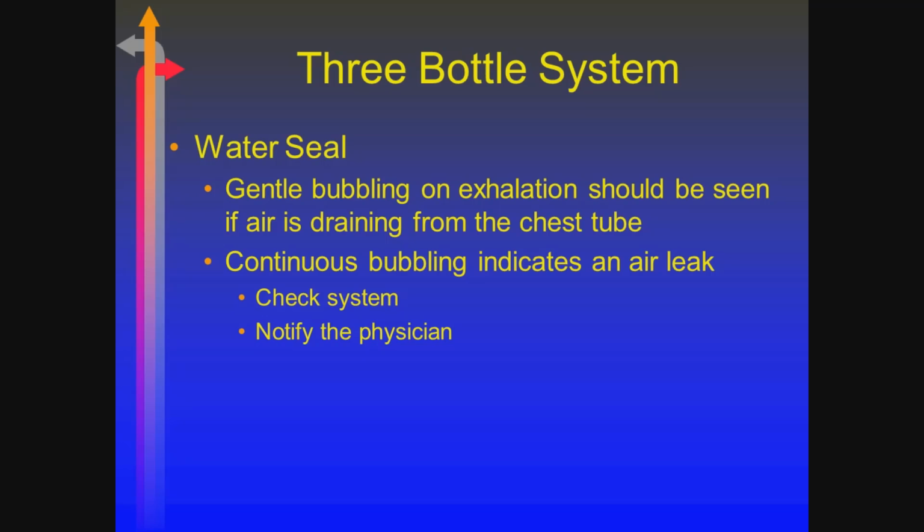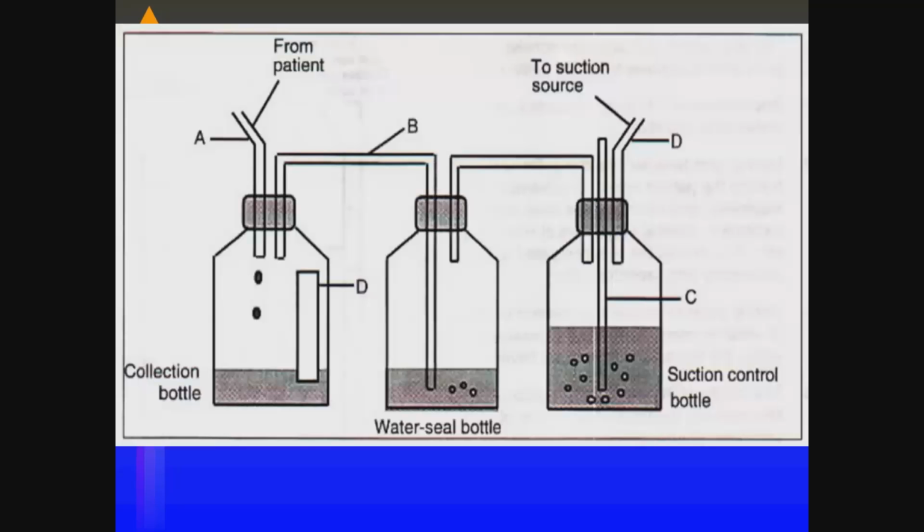When you're seeing continuous bubbling, it usually is a sign of a pretty significant air leak still, and you need to make sure that it's not something within the tubing itself that is leaking. And as you go through initial drainage, you're going to end up seeing that.